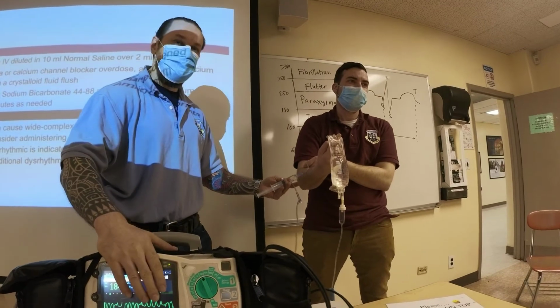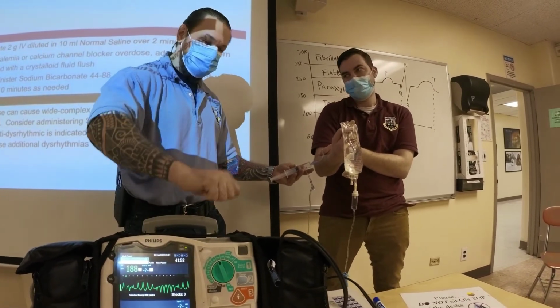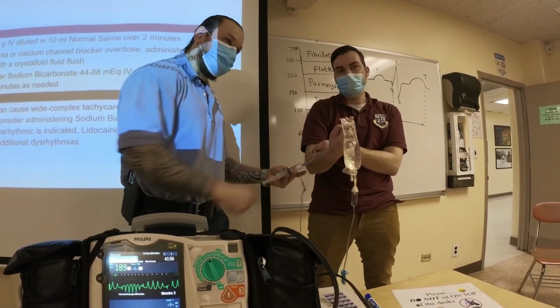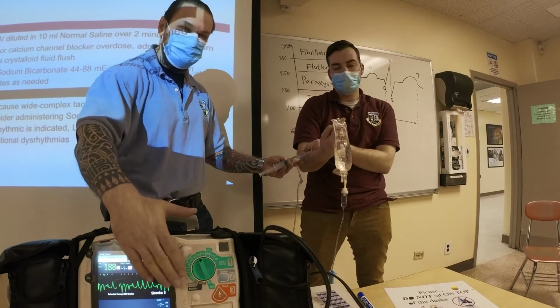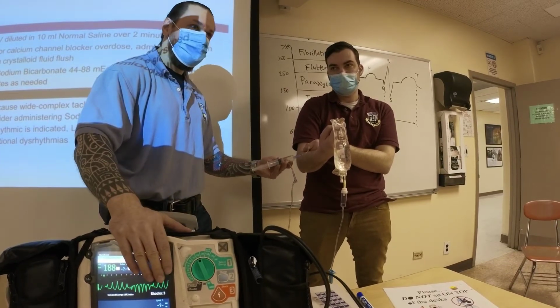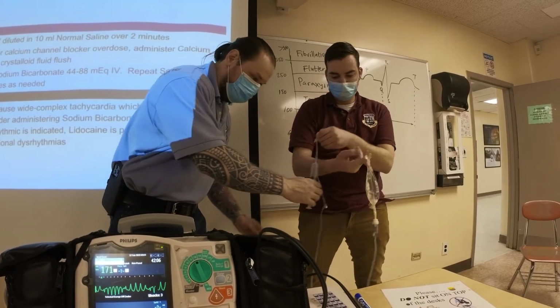I'm observing the monitor, and I have my partner probably have the pads ready, right? I'm probably not going to open them up per se, but I have them connected, so they're ready. We're laying down. Definitely connect the 12 lead, so you want to have it done. You're observing the monitor. You push the drug over 2 minutes, observing for the change, and then let's say I do have a change. I'm going to hook up the 12 lead. So thank you, you could take this.